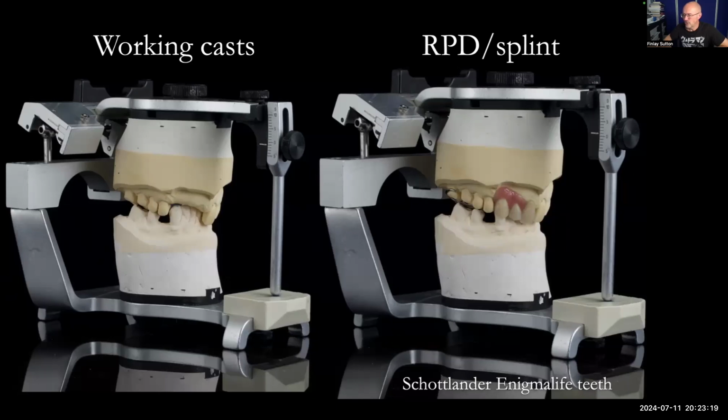So, would I do loads of crowns for this ISFE case? Probably yes, but that would be for helping me practice doing crown preps and other things, and also cost isn't an issue. But I do think that this would pass the ISFE because it's so conservative and you're protecting all of these heavily restored teeth. So there's an argument for and against stripping down and redoing. Often opening, taking a crown off a tooth, a really old crown, it can be a can of worms, can't it? You can have very little prep left, and then it weakens it, and then it may affect your root canal treatment, blah blah blah. So no is the answer to that.